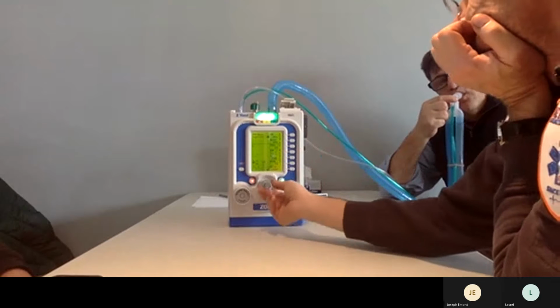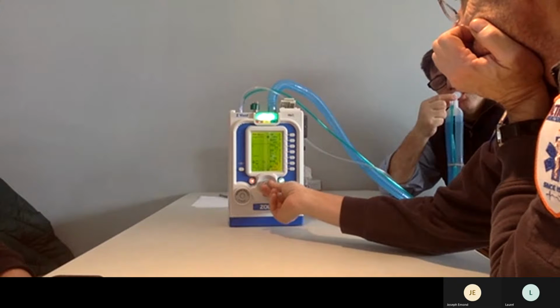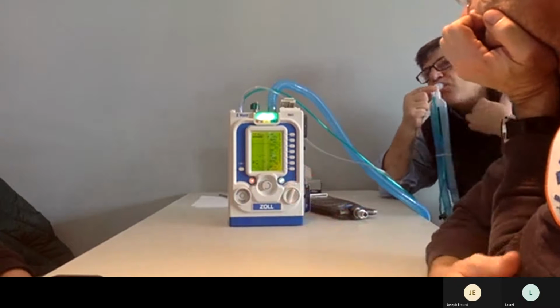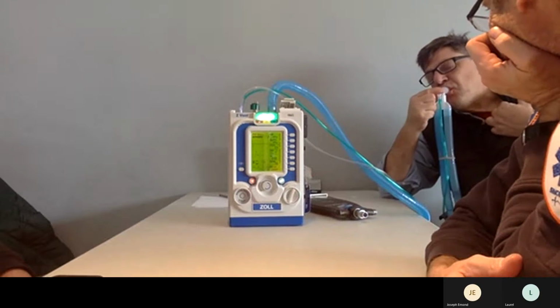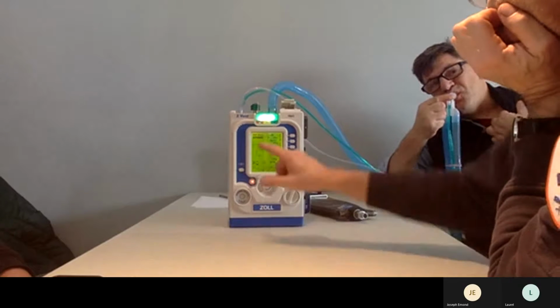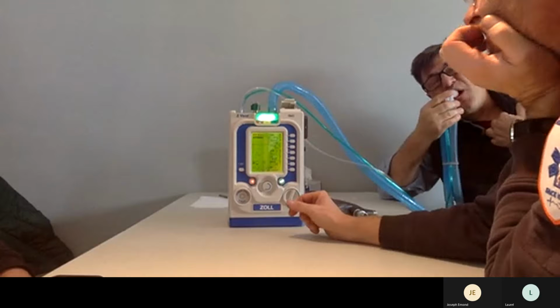Okay, the trigger level. Where's the trigger? Right, top left. He made it 6 and he's got JVD.